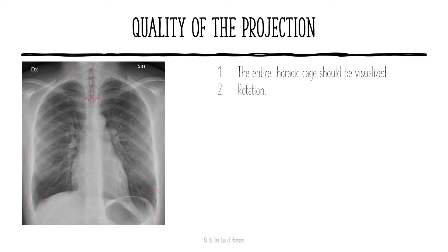Then we have to assess if we have the correct rotation. The x-ray should be taken as straight on as possible. To assess the rotation, you can look at the spinous processes of the vertebrae. You can also look at the spinous process that lies approximately in the middle of the two claviculi — it should be approximately the same distance towards each clavicle. If it goes more towards one side, it can be a sign of scoliosis or that we have the wrong rotation.